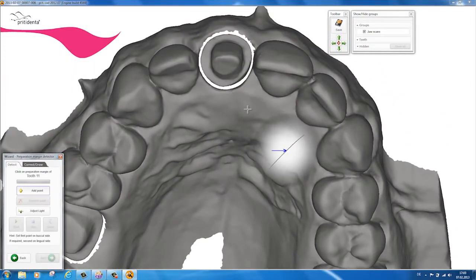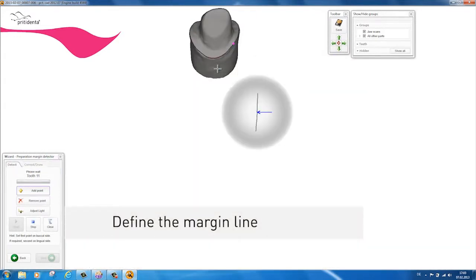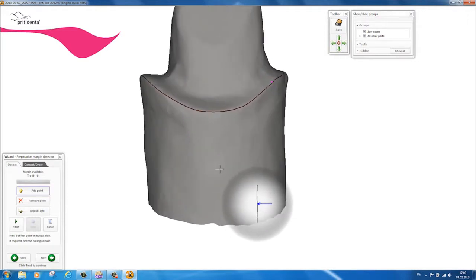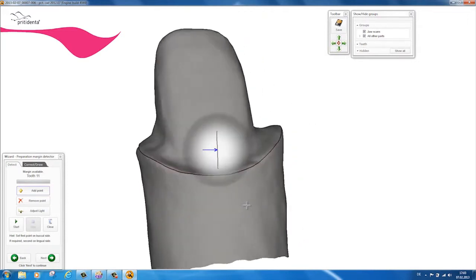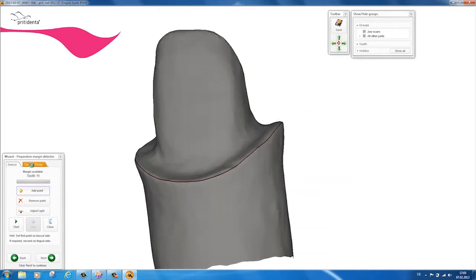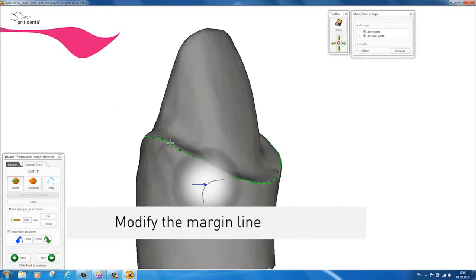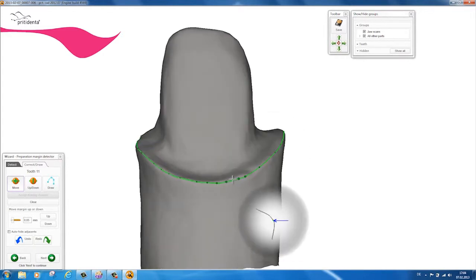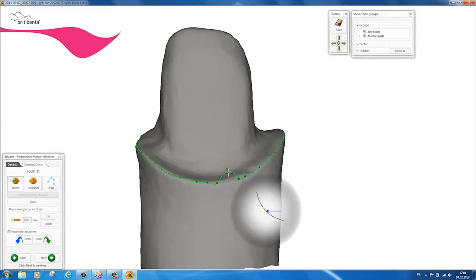You can use the 2D magnifying glass to help you define the margin line. You can modify the margin line either by moving the spline points on the margin line or by dragging the line up or down. You can also remove individual spline points or add new ones.